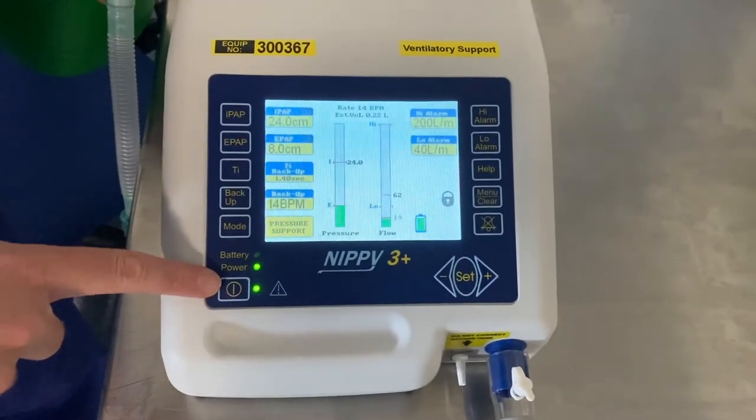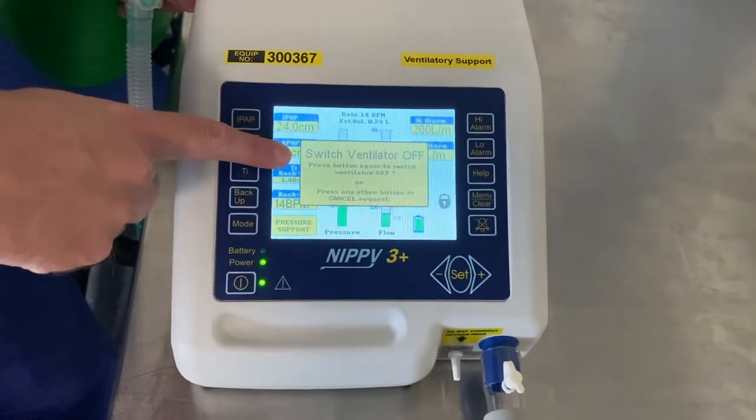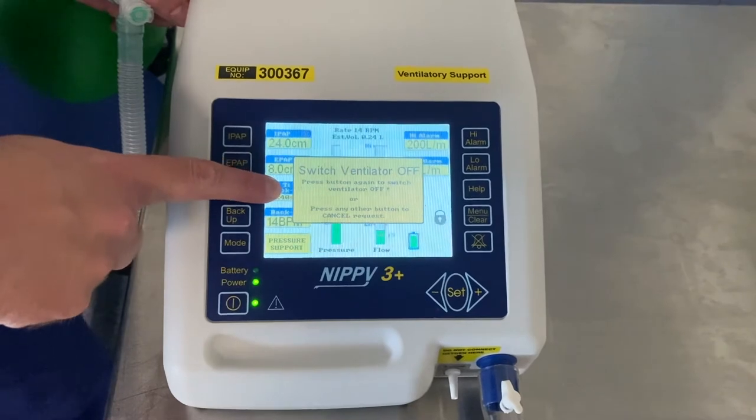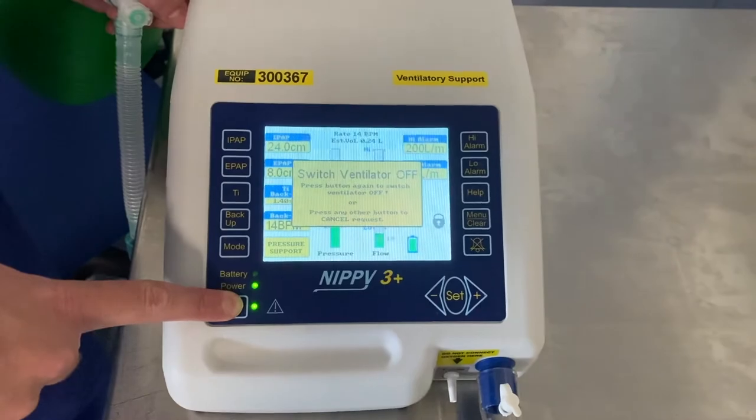To turn the machine off, simply press and hold this button. It will come up with a box asking you to confirm if you want to turn the ventilator off. To confirm, press and hold the button again.